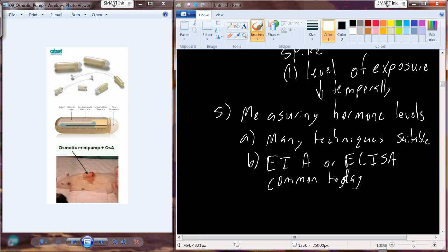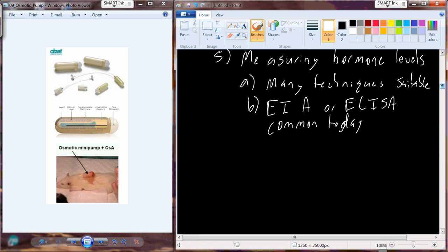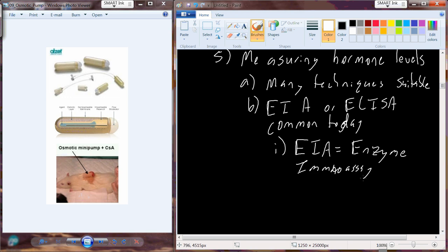And technically, they are really two names for the same thing. So EIA stands for enzyme immunoassay, where the ELISA stands for enzyme-linked immunosorbent assay.